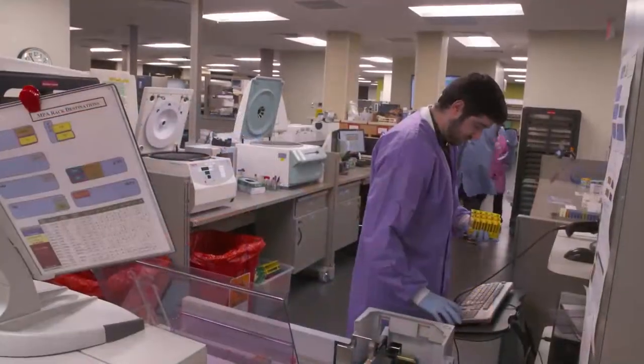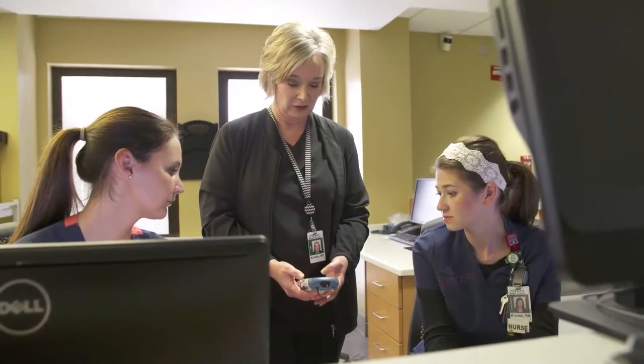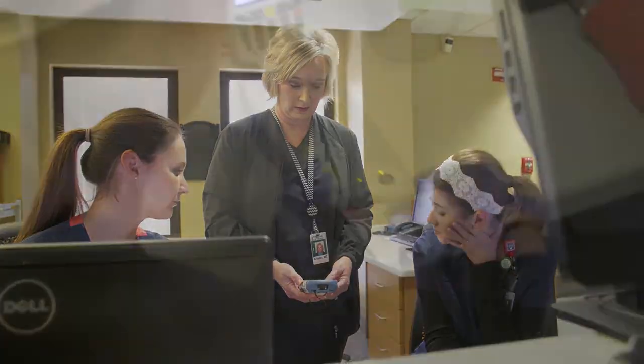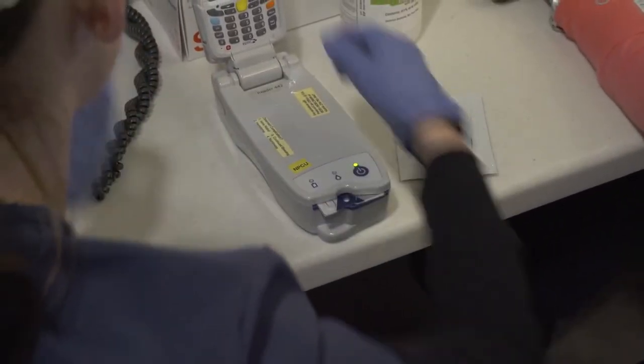That's just how long it takes. There's not really anything you can do about that. For every hour you wait to give an antibiotic, the mortality for that patient increases 8%. So now that we have the handheld device, the nurse can get those results within a few minutes and we know how to treat that patient.